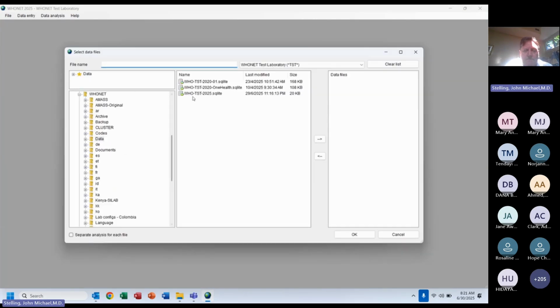And data files. This is my one month of human health data. If there's time, I would like to show One Health data, and you can do stratifications. I can do all isolates averaged together, but I can also separate it: human, animal, food, cat, dog, fish. I hope there's time for that. But I'll just start off with the human antibiogram with the human health data.